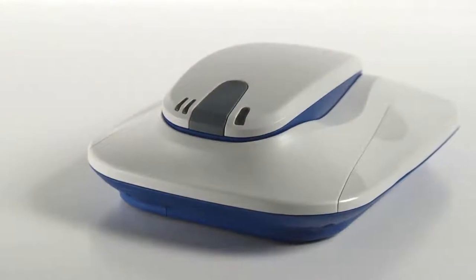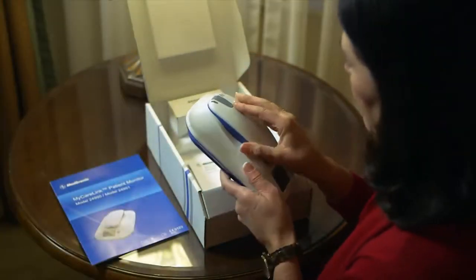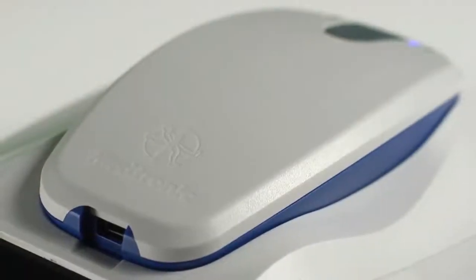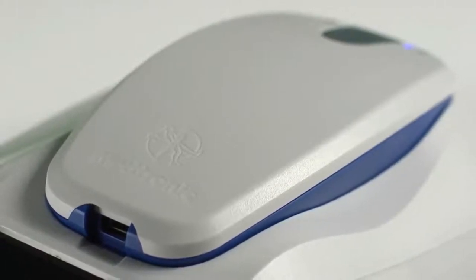The first thing you'll want to do when you get home, following the insertion of the Reveal LINQ cardiac monitor, is to set up the other necessary component to the system: the MyCareLink Patient Monitor. Proper setup of the MyCareLink monitor is necessary for the system to work, because this is the only way to move the heart information from the Reveal LINQ to a location where your doctor can review it.